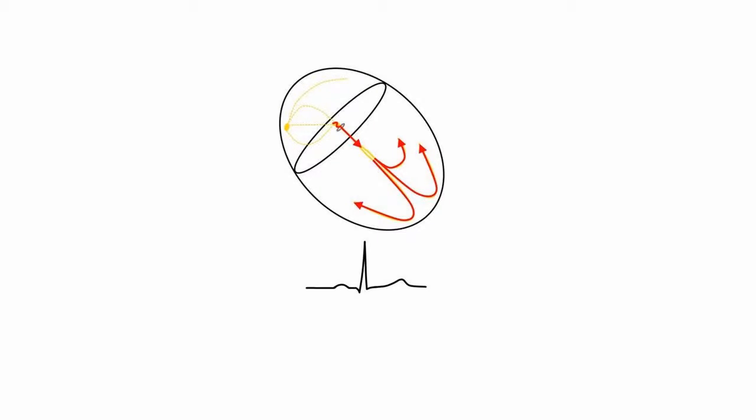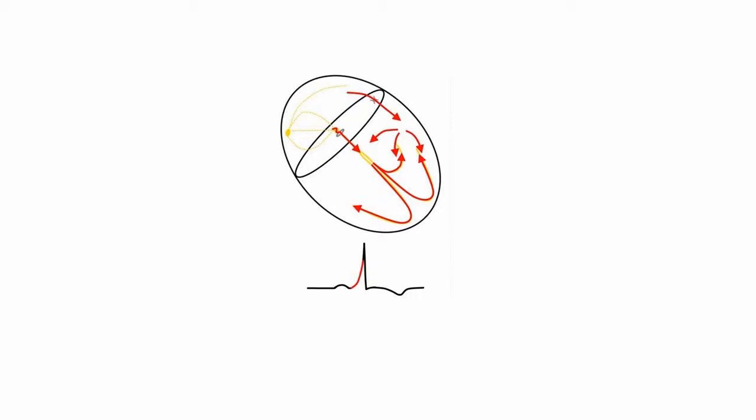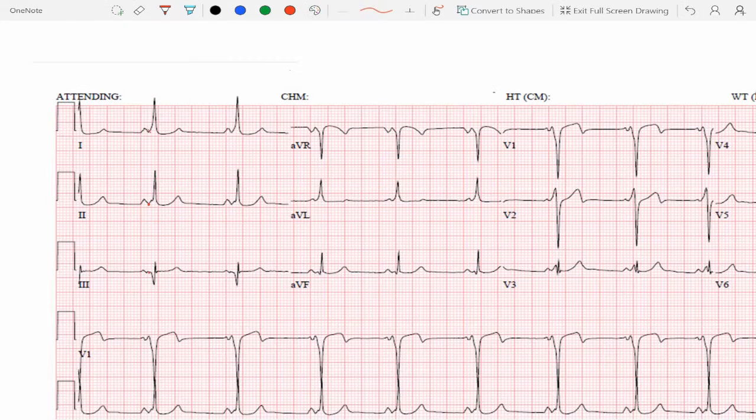Remember, when you have this His-Purkinje system, it's a very rapidly conducting cable system, and it kind of arborizes all over the endocardium, so it allows for rapid conduction to different areas of the myocardium, and rapid conduction is really sharp, and you see that narrow QRS. Right. Whereas when you conduct through the pathway to the ventricle, you don't have the benefit of conducting through the conduction system, so you have to conduct cell to cell through the myocardium, so it's delayed, and therefore you see that slurred pattern. The slurred pattern is just suggesting that there is delayed or slower conduction.